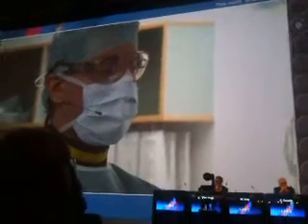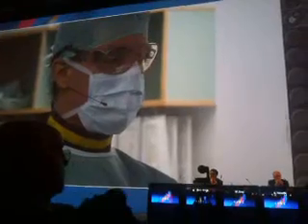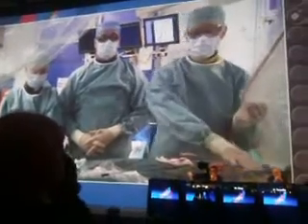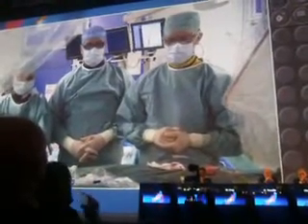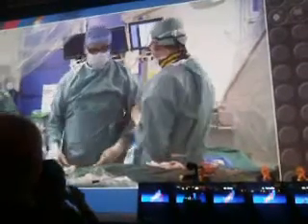So what we do usually now is, although the graft has a diameter of 22 French, we do this percutaneously with 2 ProGlides preloaded here in the groin. That has been done already now. And these are typically young patients with not a lot of calcium here in the groin, so this works actually quite nicely. And we have done also another angio.